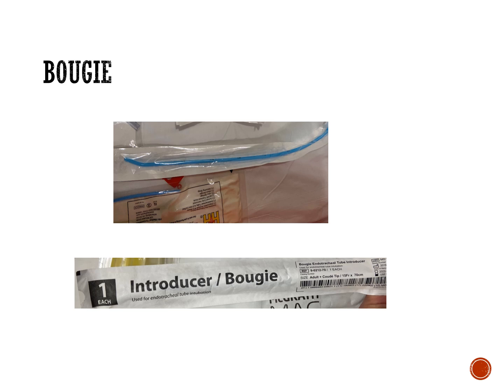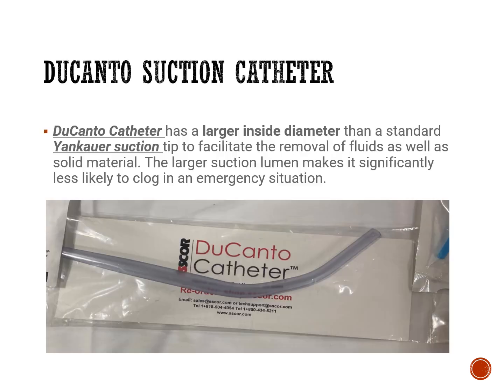I don't use them myself, and again, I'm not opposed to them. I just don't use them myself because it's almost like having to intubate twice. But I've had them near me. I've assisted others, and some of our trauma surgeons use them a lot. They're used to worst case scenario facial trauma, so maybe they get into that habit too.